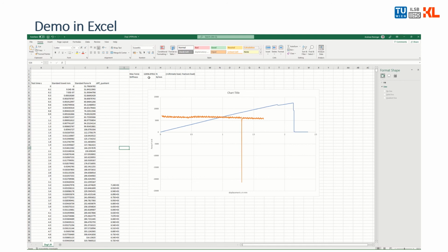And now this is it, and I take now the maximum value again of my differential quotient column, maximum of D. And this is this value. So this is maybe the value of the orange curve, something like here. Somewhere here. So this is the maximum slope of the blue line.